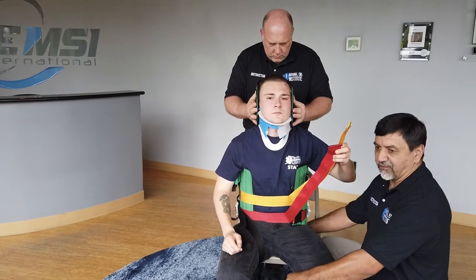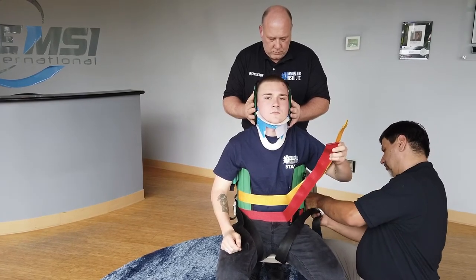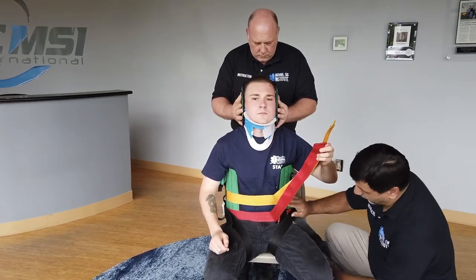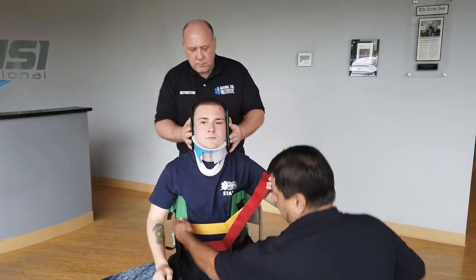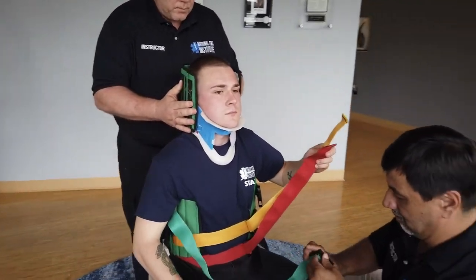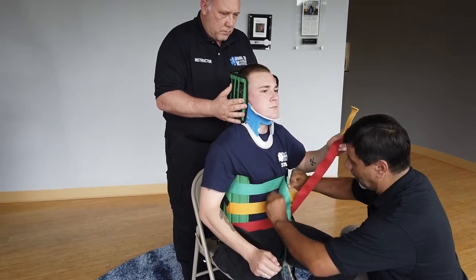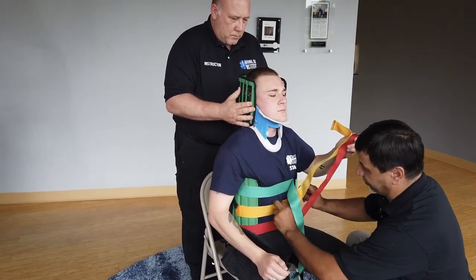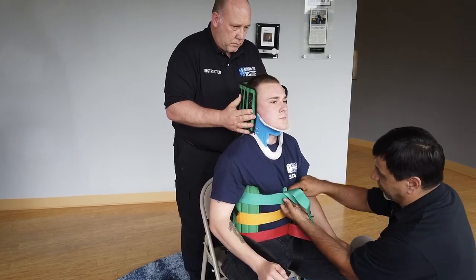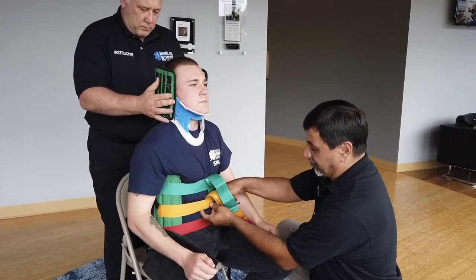By getting these straps in, it's almost like a flossing motion as you floss your teeth, trying to get them into position so it's a proper fit. So now at this time we have our middle, bottom, and leg straps — we want to go ahead and do our top strap. Always rechecking all these straps to make sure they're snug but not over-snug so that they're not impeding circulation. We want to fold up the excess straps and tuck them in behind to use as padding so we're not discomforting our patient, and also so we don't trip over the straps as we're getting ready to move the patient.